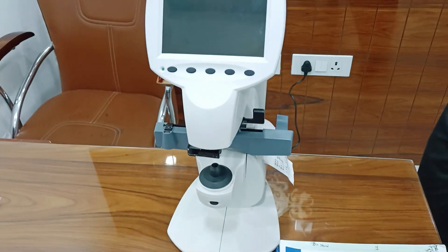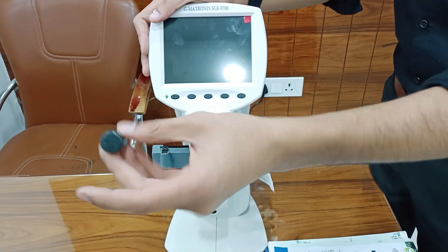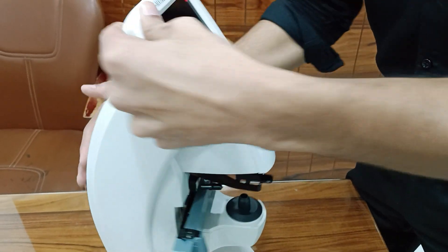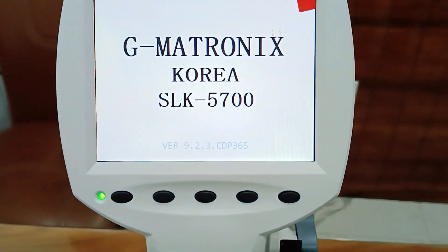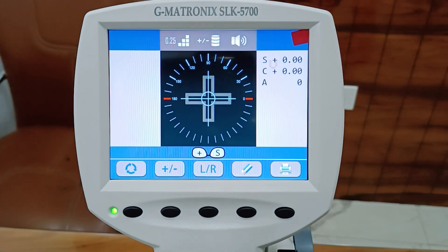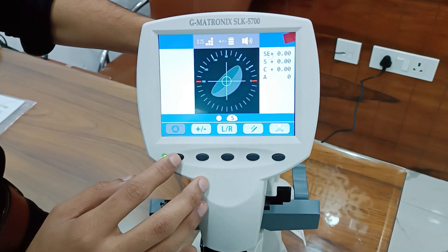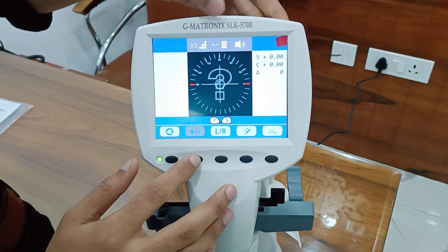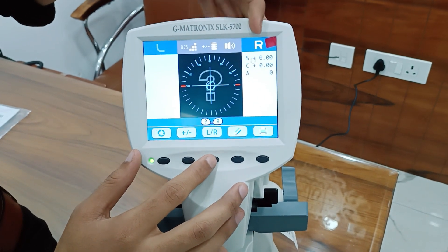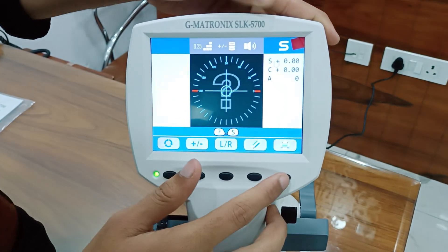When you turn on the lensometer, you have to remove the cap, otherwise your lensometer will hang. On the GMATRONIX SLK5700, the menu key press one changes cylinder plus, minus, and mix. There are also left, right keys, an eraser, and a printer key.